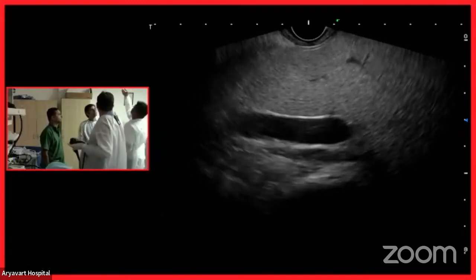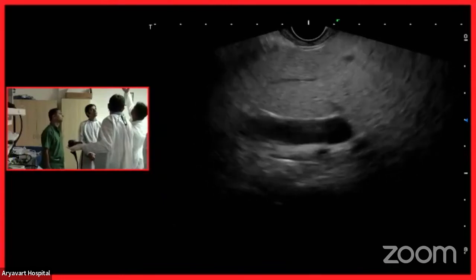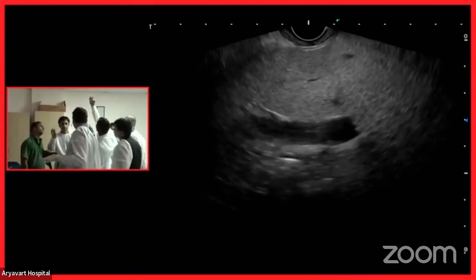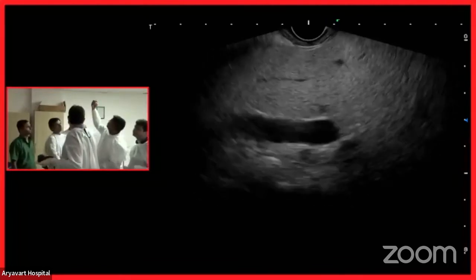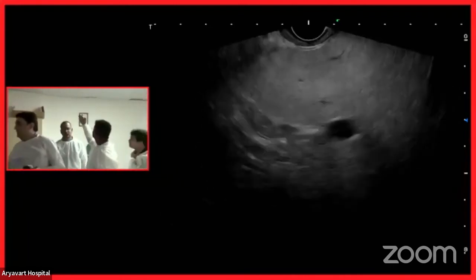Is it broken, or are they not able to see? The fragments are definitely there. Fragmented, and I think the liver is there, surrounded by vessel. There is a core tissue. Can the camera focus here actually? So you can put it, I think, clear about it.